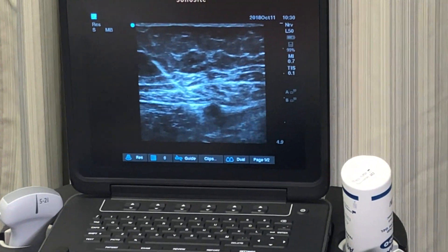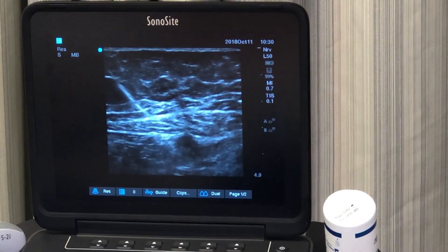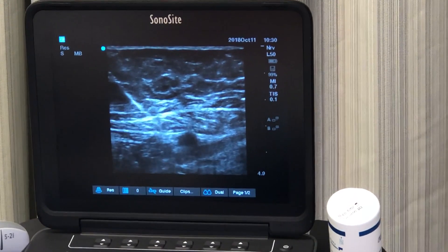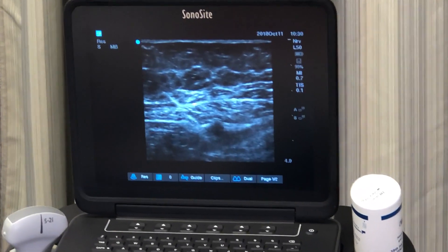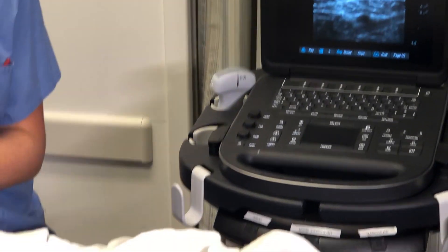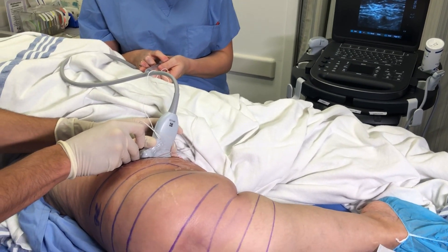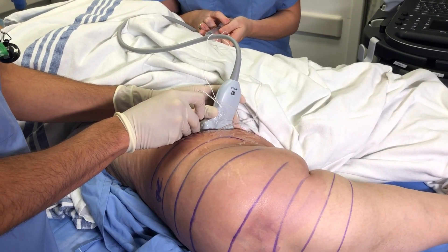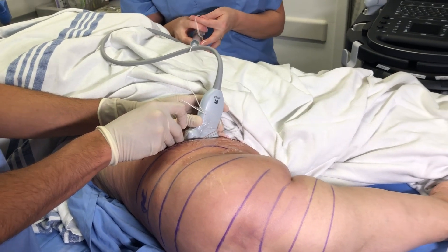I'm using the image to find my needle. Just aspirating there — it's clean. It's going well. We can see the medication spreading in the proper location in the leg there.